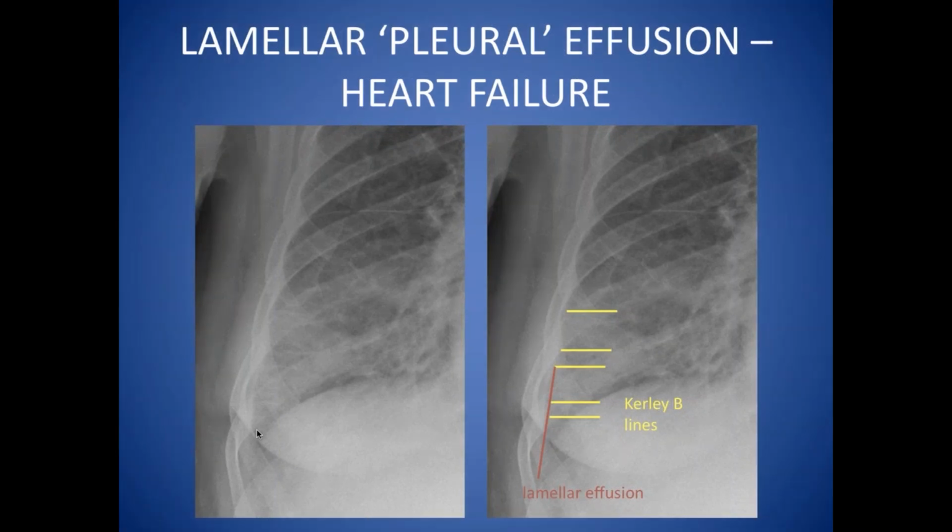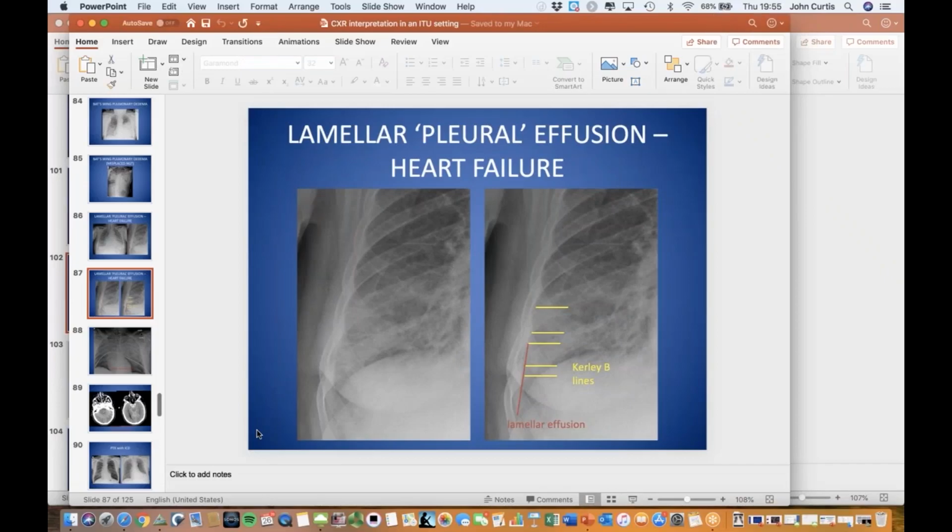Somebody's asking me, what's the distance for the ET tube again? Ideally, it should be 4 centimeters away from the carina, but you are allowed for it to be no nearer than 2.5 centimeters and no further than 5 centimeters. If it's any nearer than 2.5 centimeters, there's a danger that you can intubate either of the main bronchi during flexion of the patient's neck.